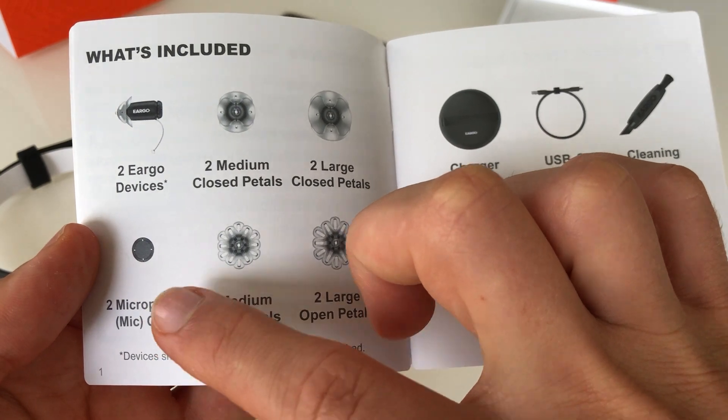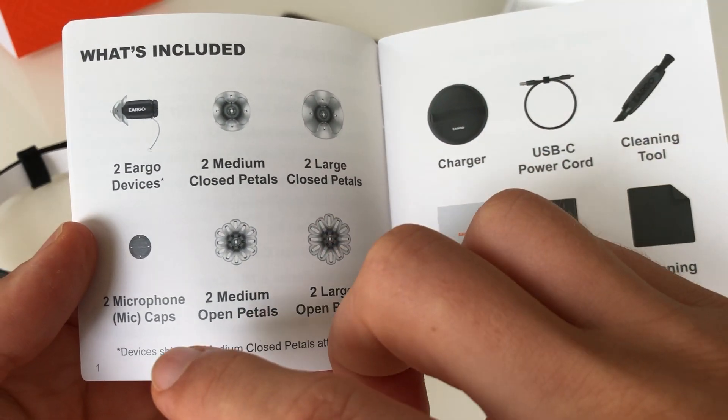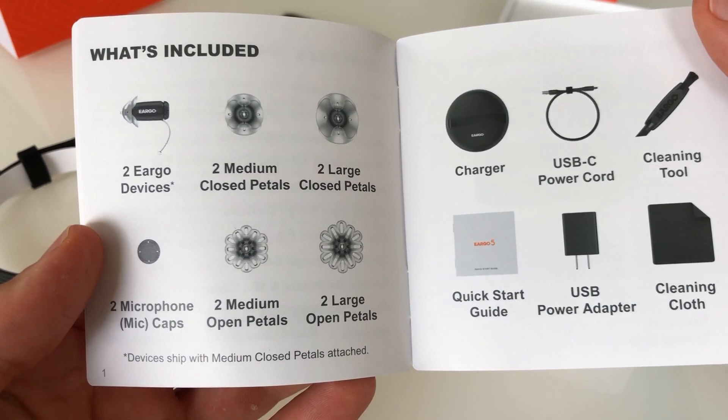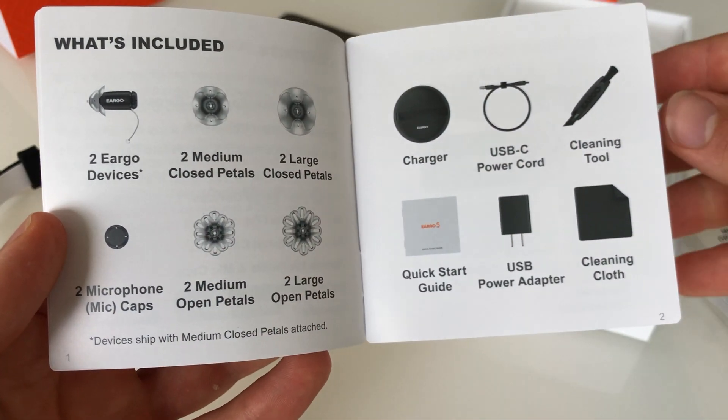The microphone caps — this is the piece that goes on the end of the hearing aid right there. Sometimes those microphone caps, when they're living in the ear canal, which is a notoriously difficult place for electronics to live, it is beneficial to change out these little caps.